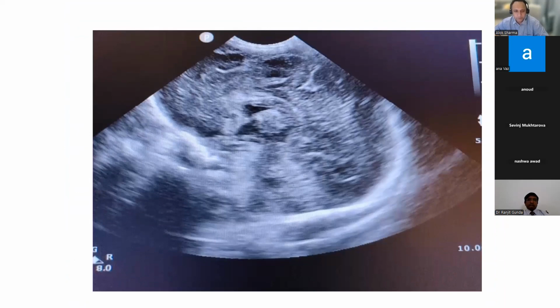Also here, I was not able to see the corpus callosum at all. Even the mid sagittal, it didn't come with me at all. The corpus callosum here in this slide, there's marginal visibility of the body of the corpus callosum, but anteriorly I can't see it at all, and posteriorly I can't see it well at all.